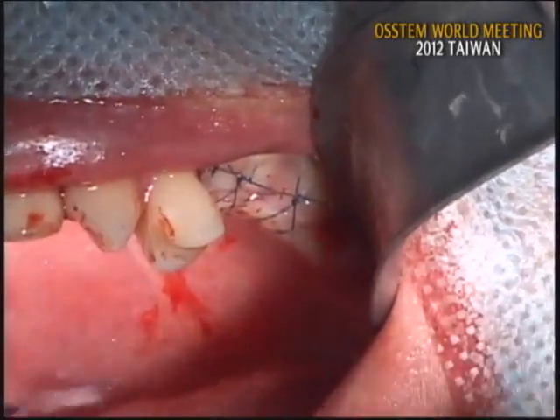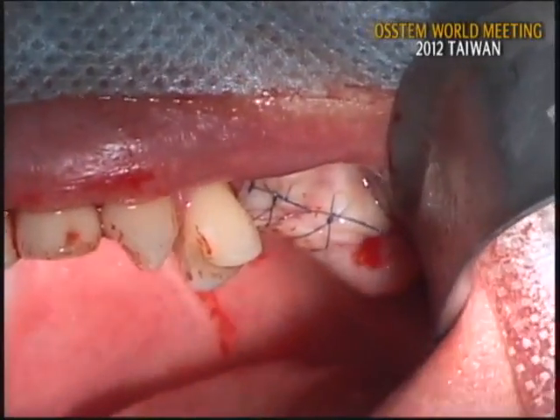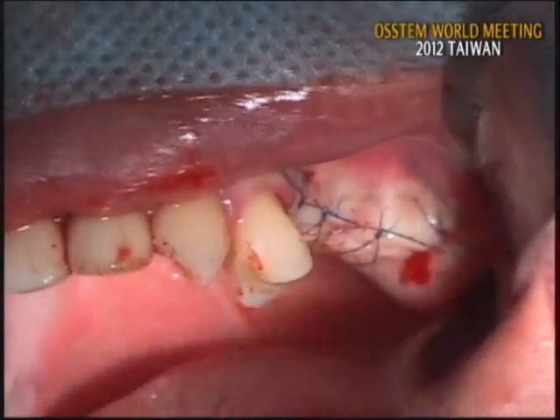Can you take the radiograph? Okay. Let's take the radiograph. Okay. Thank you for your attention.